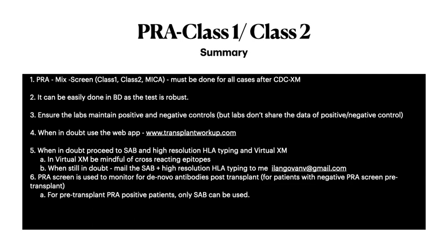So for pre-transplant PRA positive patients, only SAB can be used to monitor in these situations. This test can also be used for post-transplant monitoring. Going on to the next thing, which is flow cross match. Again, a very interesting and important one.